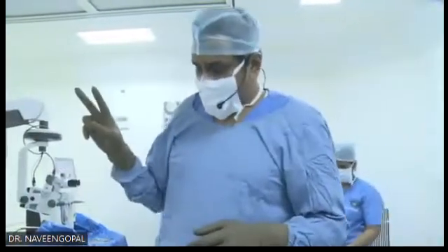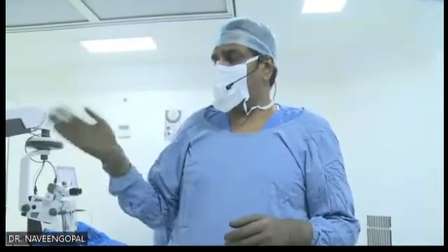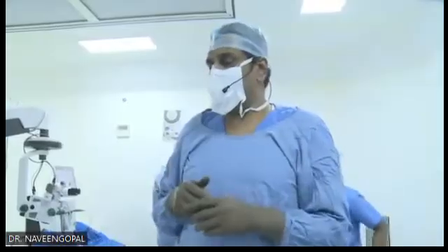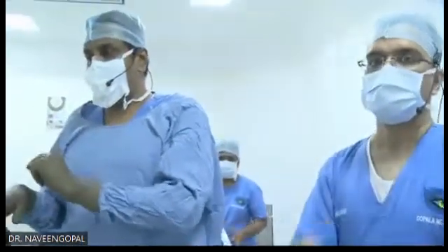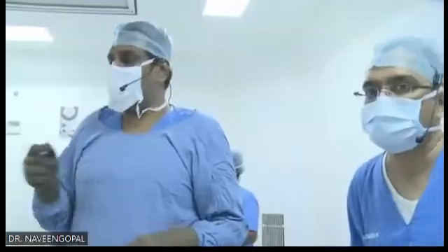I have removed the ICL for 2 reasons, both being that when I placed the ICL and it came out, it went the other way around. That was handled during the procedure itself. The advantage of Biotech is they give you 2 lenses. If one lens breaks when you're taking it out, there is always a backup lens. You can put that also. That is the advantage of Biotech.